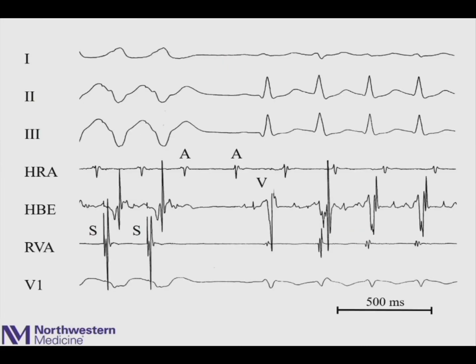And here's an example of an atrial tach. You can do this in the EP lab when the patient's on isoprel with sinus tachycardia. So next time you're in the lab and someone has AV nodal reentry and they're in sinus tachycardia and you pace the V and you don't induce AV nodal reentry, you'll see a VA-AV response. There's a little better His recording for you.